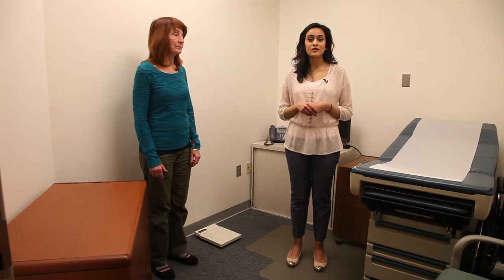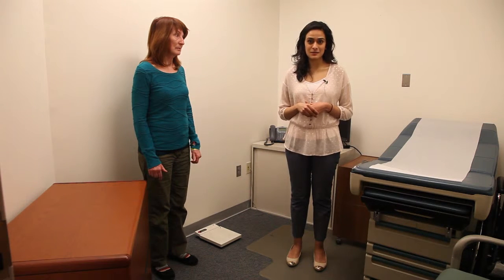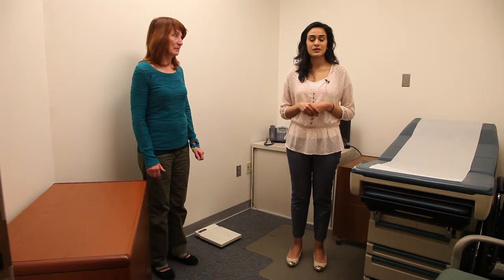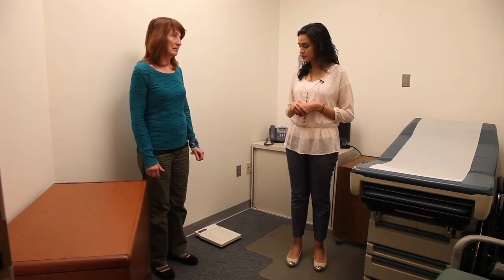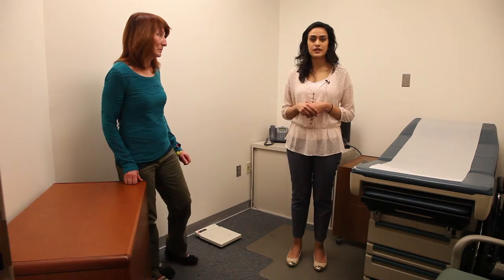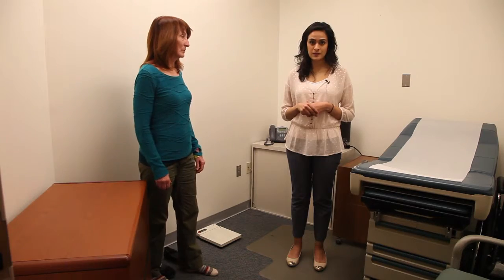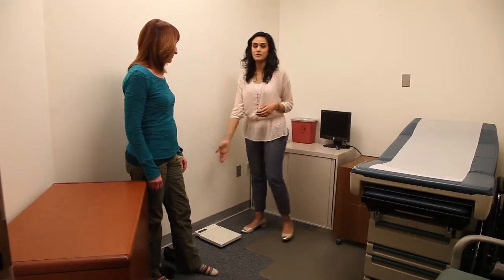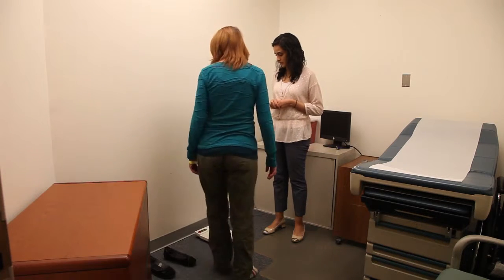We are now going to begin with the first component of the frailty assessment tool. That will be measuring the patient's height and weight. Please ensure that the patient has removed their shoes and any extra heavy clothing that may skew your results. Ensure that your scale has been zeroed and have the patient step onto the scale to get a measurement.